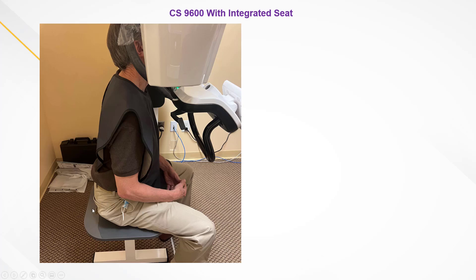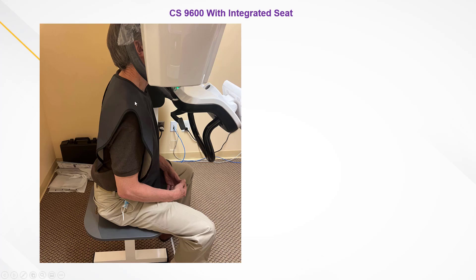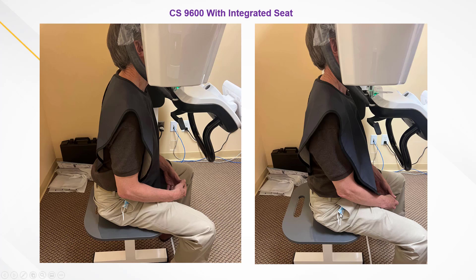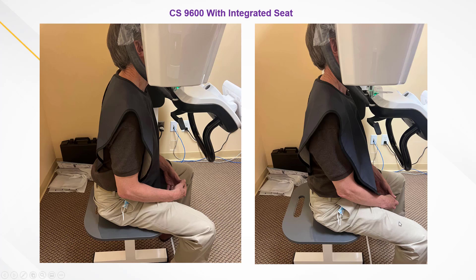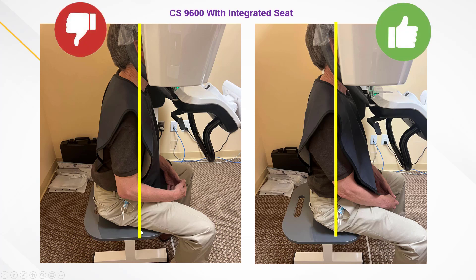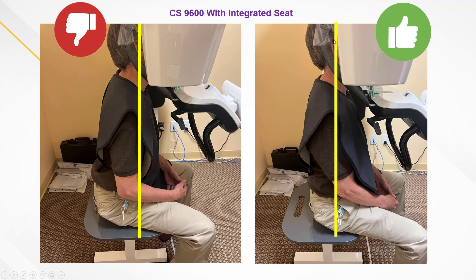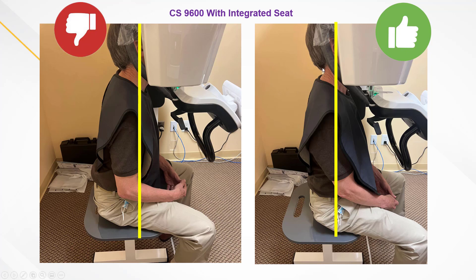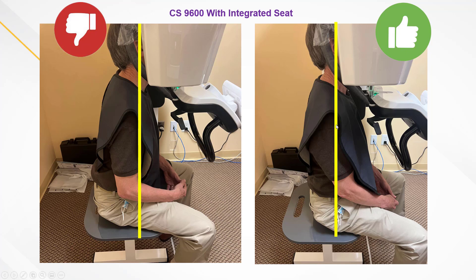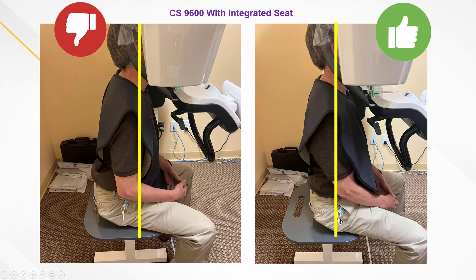When a patient normally sits down, they're going to be shifted or scooted back further on the seat and kind of tilted forward, similar to what I was showing on the other images. What you want to do is have the patient scoot forward so they're sitting on the front half of the seat. The patient's feet will also be more planted on the ground for stability — especially if they're shorter. You can see the same type of reference line: in the poor position the patient is further behind the line, and in the correct position they're really lined up nicely, the patient is seated nice and straight with good posture, good positioning, and nice and stable.